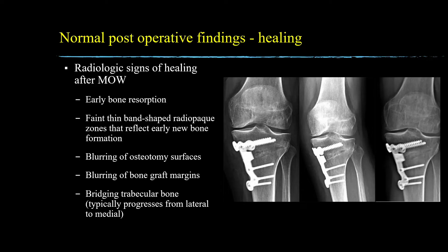Radiographic signs of healing after medial opening wedge HTO include early bone resorption, faint thin radiopaque bands that reflect early bone formation, blurring of the osteotomy and bone graft margins, and finally bridging trabecular bone. These images demonstrate sequential frontal knee radiographs showing a post-operative MOW-HTO using a locking plate and screw fixation at two weeks on the image on your left, six weeks in the middle, and 12 months on your right, showing radiographic signs of progressive healing.